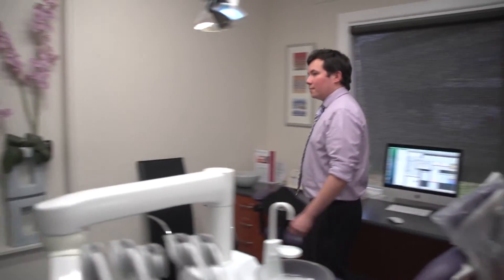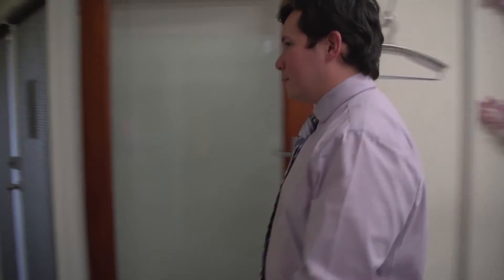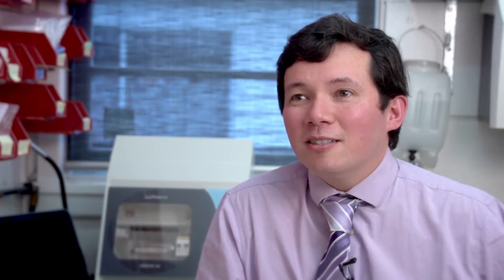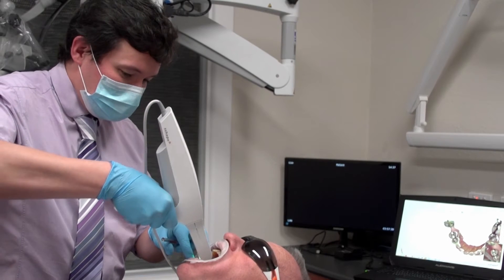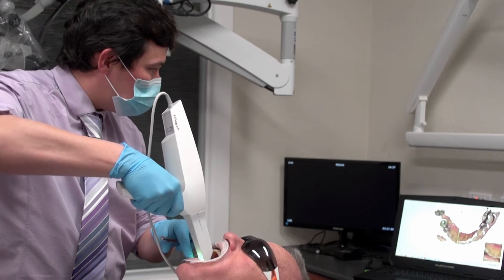I must admit I didn't jump into this digital dentistry overnight. I actually had some serious trepidation and concerns about implementing in the practice because I could do things quite happily using traditional techniques. And so looking at digital dentistry it involved changing how I was doing things and changing is often hard. However I could see that digital technologies were going to change how we worked in dentistry. So I felt that there was a definite need to get on board and certainly get on board before the trains left the station.